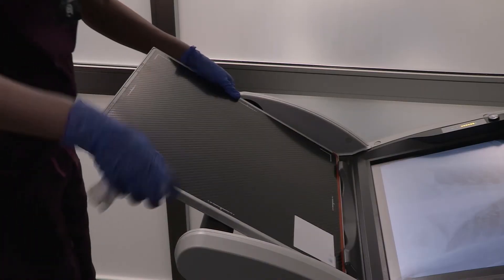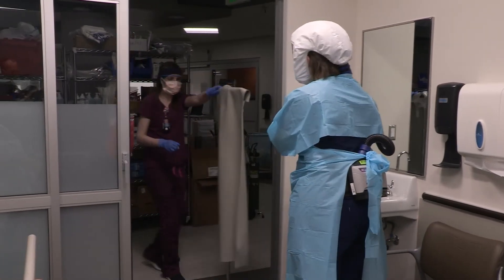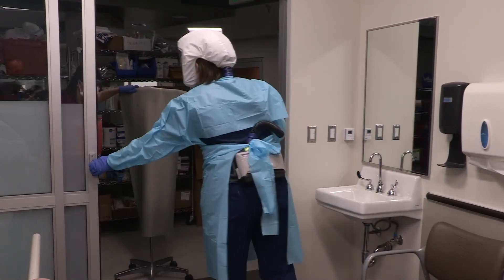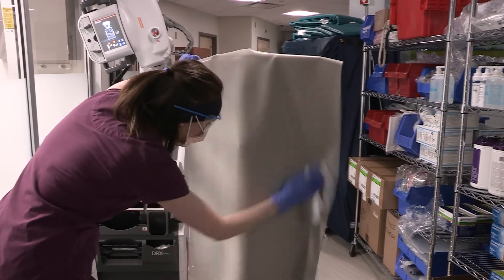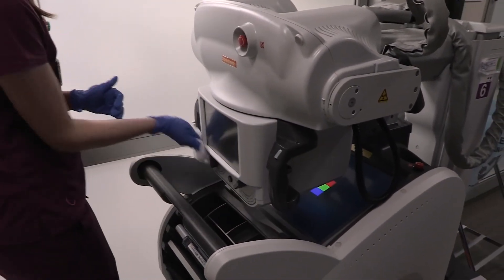The technologist will then clean the cassette. Next, the nurse will pass the lead shield to the technologist through the open doorway. The technologist will clean the lead shield, the x-ray machine, and doff PPE as appropriate.